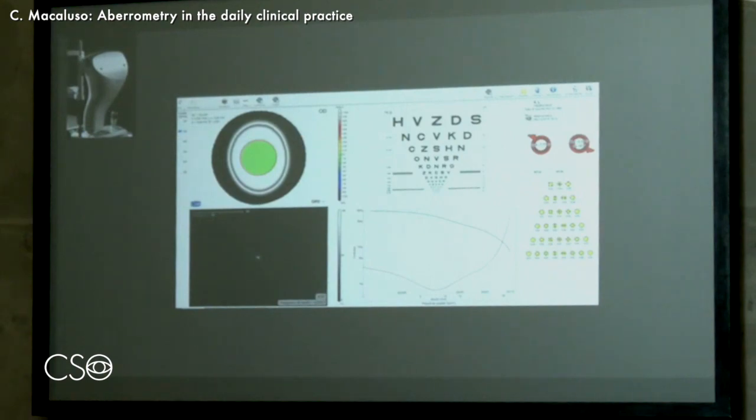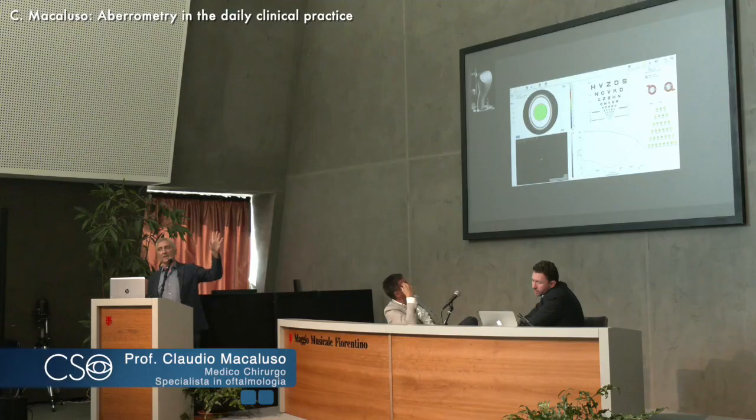That is, using lenses. You see on the right, there is a cylinder and sphere, and we can play with those and manipulate. And actually, if you click the BCVA, Best Corrected Visual Acuity button, the software is going to do the work for you.